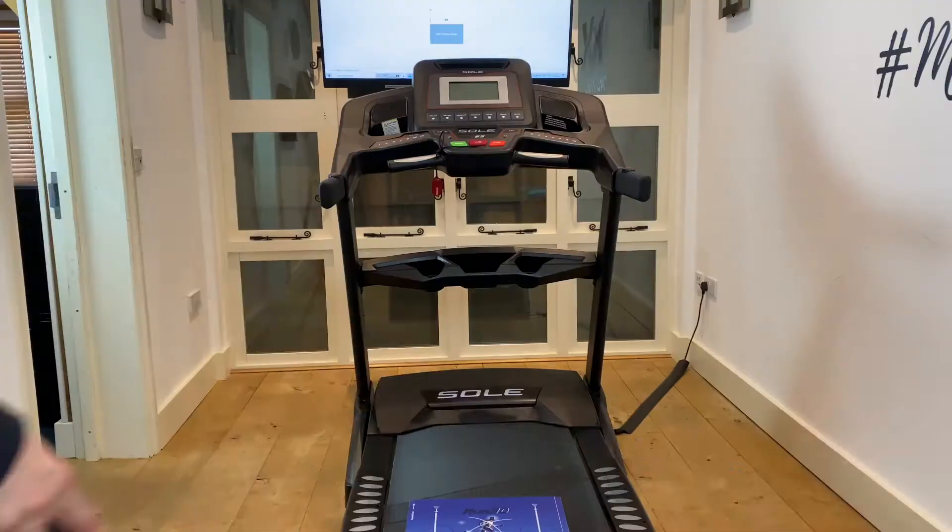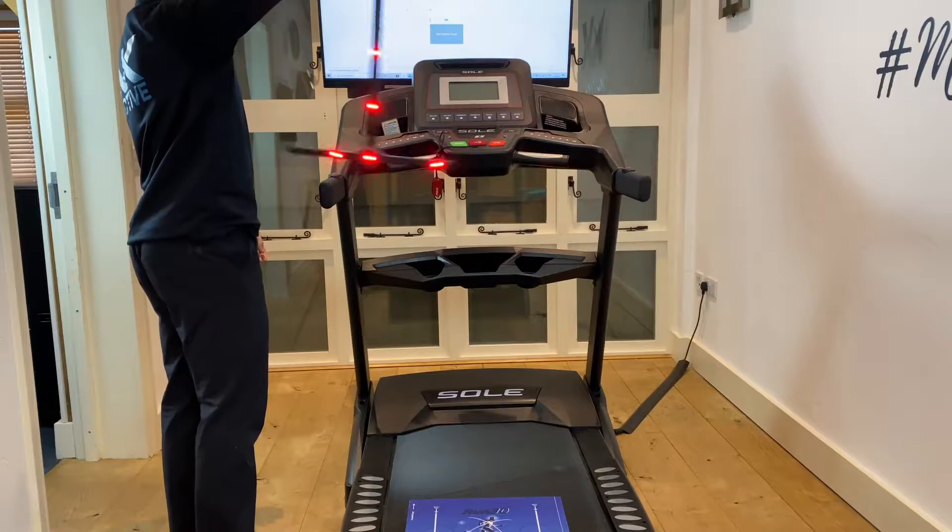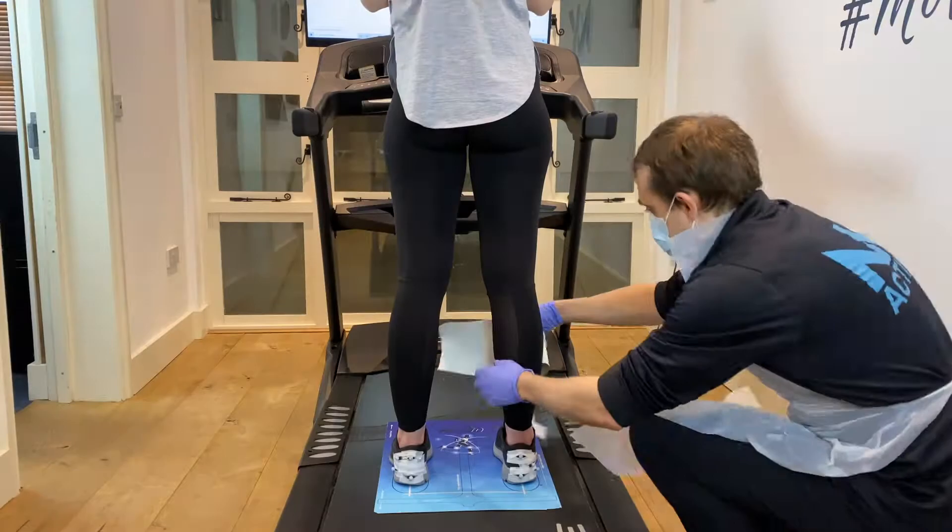First things first, load the patient to the system and then we have to calibrate the camera — to tell the camera effectively where the treadmill is.